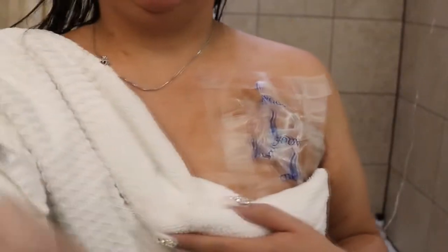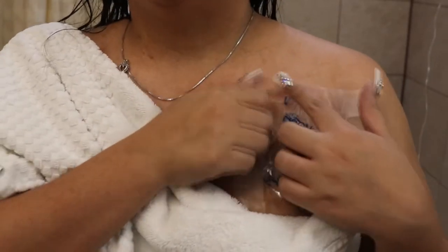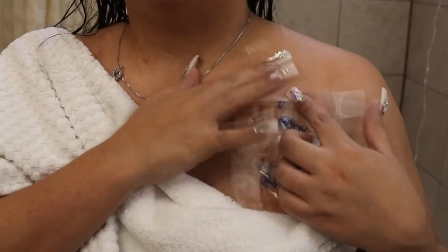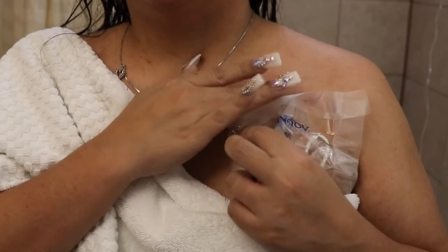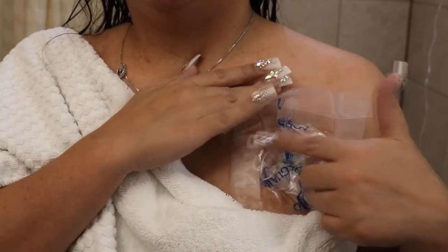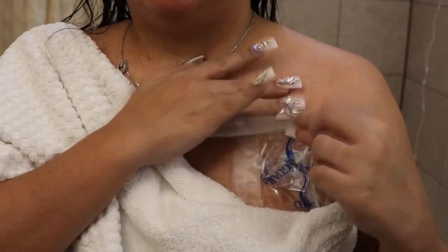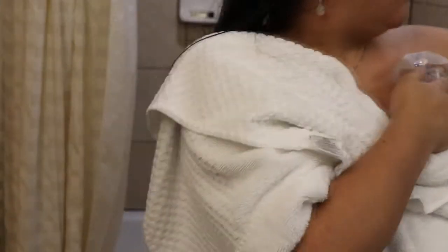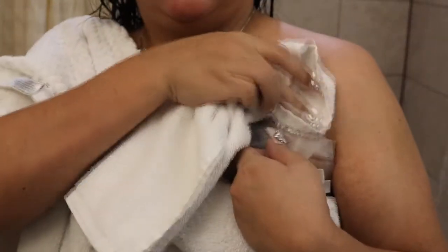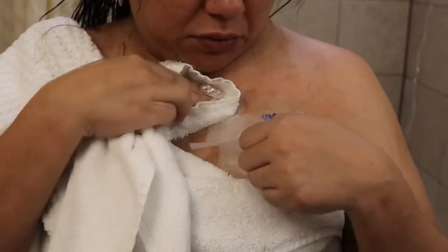I'm trying to. So you pull gentle, super gentle. Oh, see, you can feel it. Push the skin back and go slow. Don't go fast, because if you overlap any of this onto your Tegaderm, it's gonna come right up. So then I come down and I like to grab a towel because usually there's moisture, and just do that and pull down.